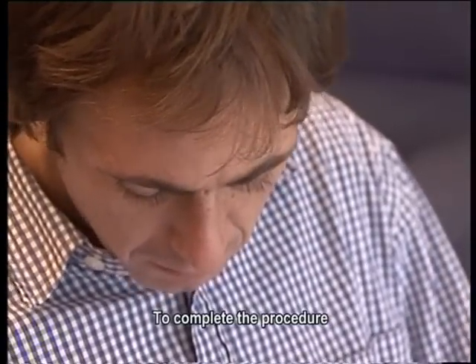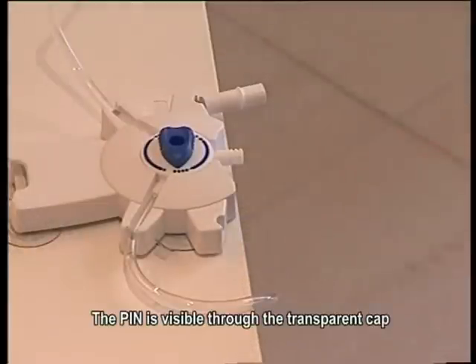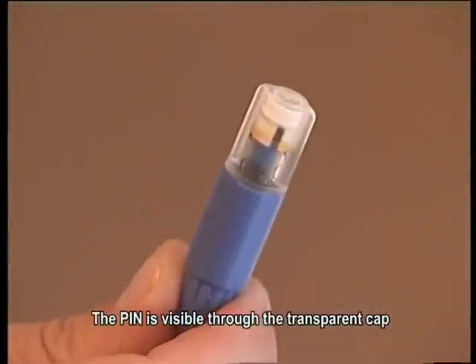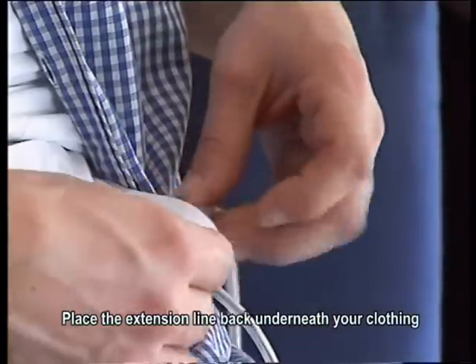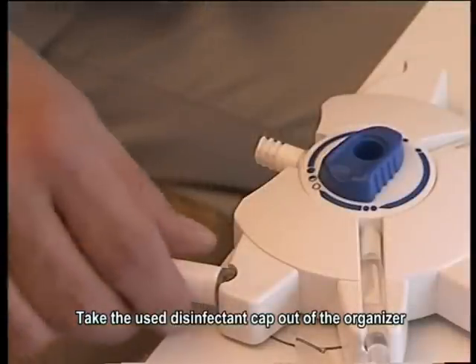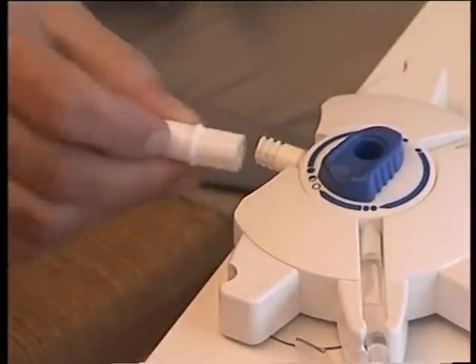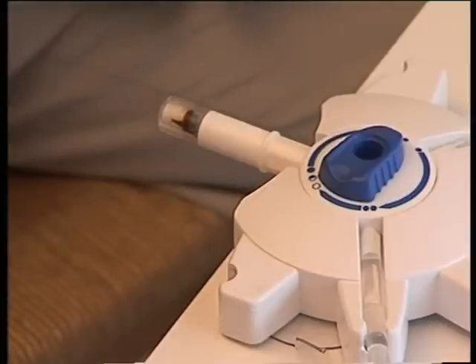To complete the procedure, remove the catheter extension line from the organizer. The pin is visible through the transparent cap. Place the extension line back underneath your clothing. Take the used disinfectant cap out of the organizer. Turn the cap and screw it onto the disc to close the system.